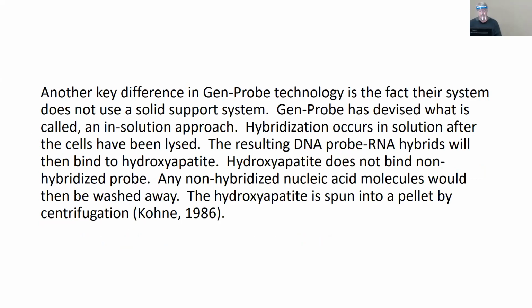So their technology does not use a solid support system. It has devised what is called an in-solution approach. Hybridization occurs in solution after cells have been lysed, resulting in DNA probe RNA hybrids that bind to hydroxyapatite. Hydroxyapatite does not bind to non-hybridized probe. Any non-hybridized nucleic acid molecule would then be washed away, and the hydroxyapatite is spun into a pellet.